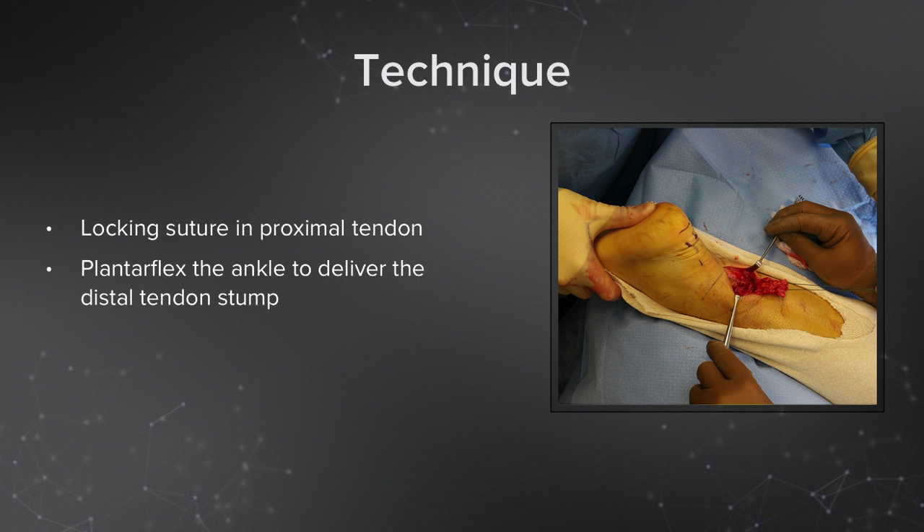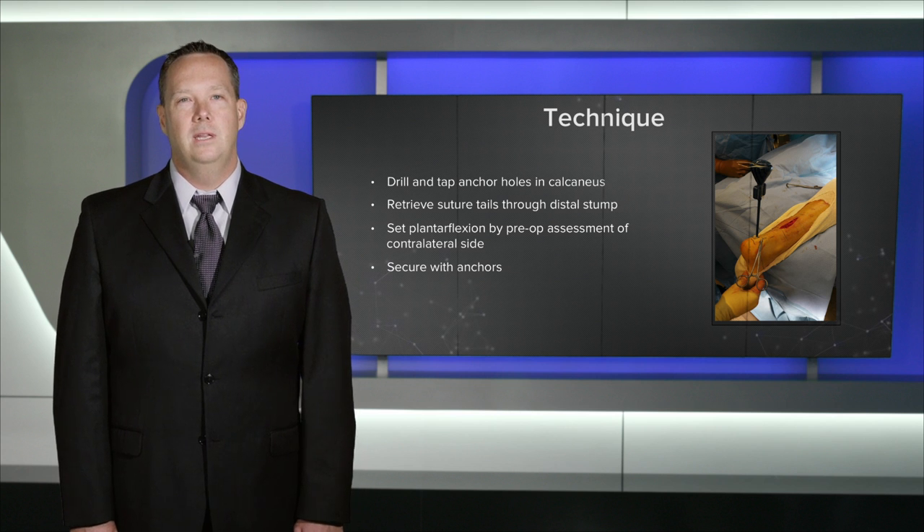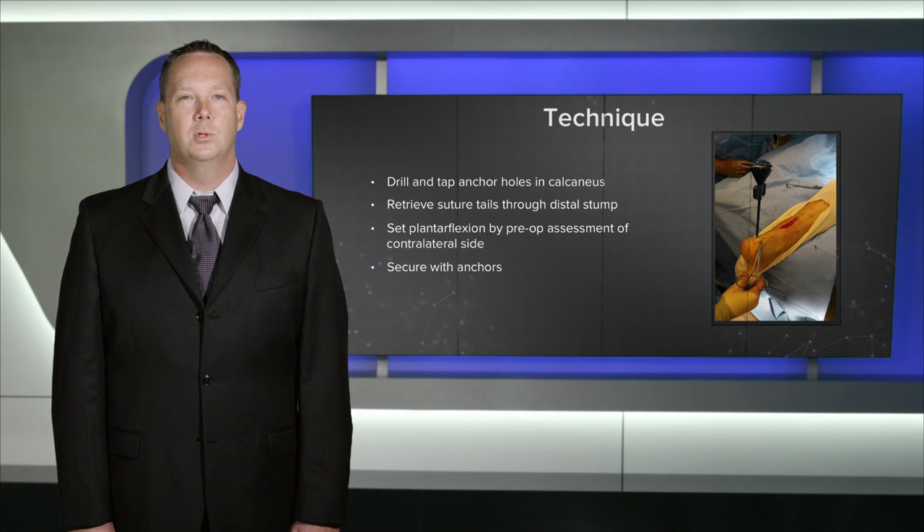Moving on with the repair, I use a locking Krakow suture in the proximal portion of the tendon, and I then plantar flex the ankle in order to deliver the distal tendon stump into my surgical incision. Moving distally to the calcaneus, I'll drill my anchor holes and tap them. I'll then retrieve the suture tails with the suture lasso and bring them out through the percutaneous calcaneus holes. I'll then look at the plantar flexion and set it by pulling my sutures tight and clipping with a hemostat against the skin in order to set it similar to my preoperative tension on the contralateral side.